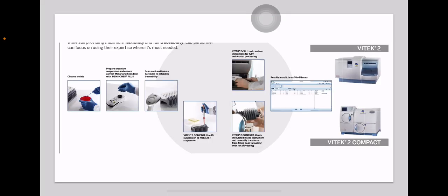Next, here's the procedure on how you are going to prepare a suspension as well as how you are going to load your sample into the Vitek 2 Compact equipment.